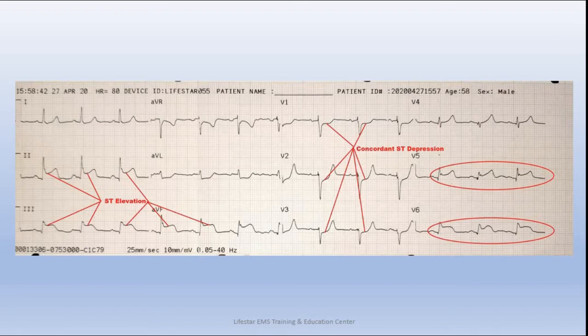I'm hoping you're seeing some very obvious ST elevation in leads 2, 3, and aVF, and then all the way over on the right in V5 and V6, you're seeing some lateral ST elevation too. So this is very much a STEMI.